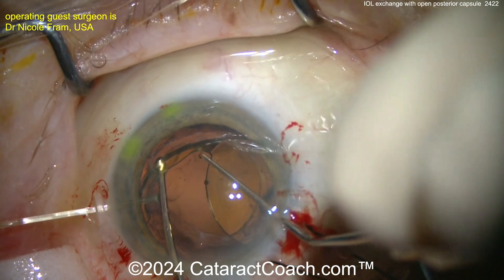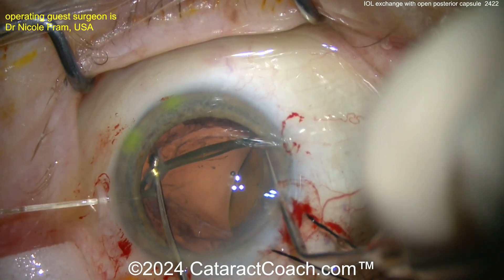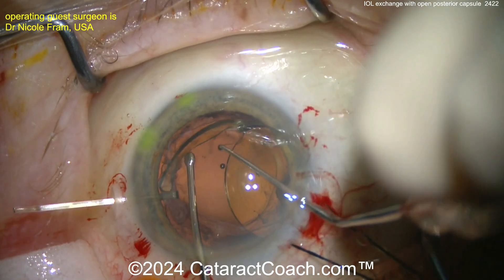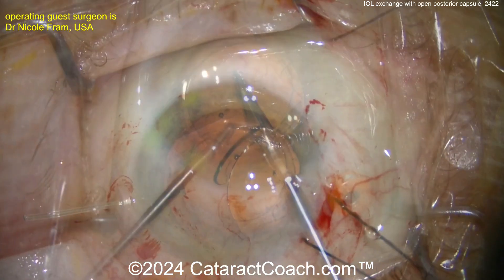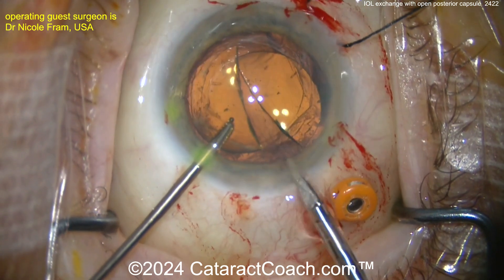You can see a beautiful job here, slowly dissecting out that IOL. Now I know what you're thinking — the posterior capsule is open, so how are you planning for the new lens? Well, you're obviously going to do a sulcus-based three-piece IOL with haptics in the sulcus, and hopefully you get the optic capture through the rhexis.